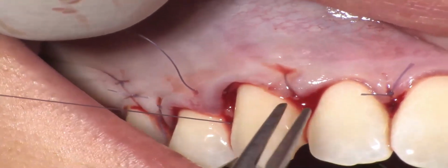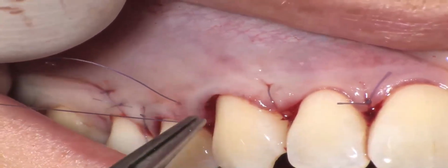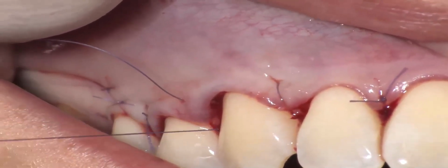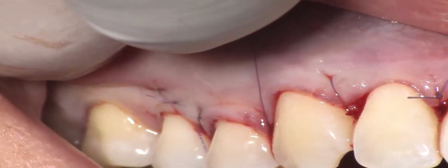Now I have to pull because I have to achieve the ischemia of the keratinized tissue at the level of the canine and at the level of the premolar.